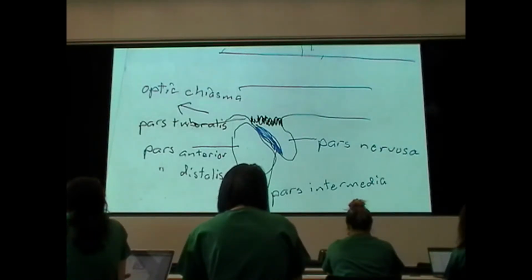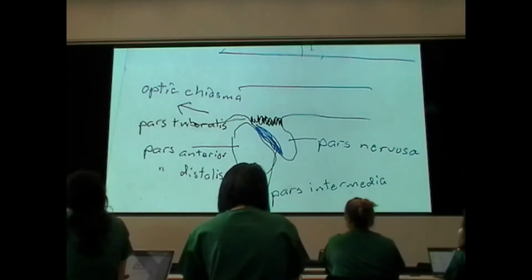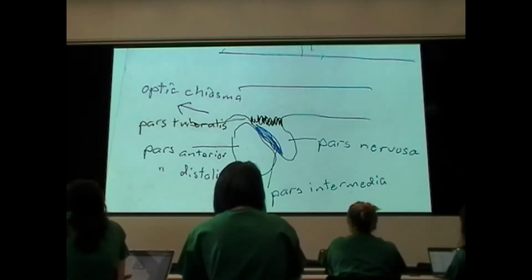Then what you do is you take a slide of pituitary unstained and flood it with this fluorescent antibody. When examined in a fluorescence microscope, which uses ultraviolet light as the source of illumination rather than visible light, what will happen is that the fluorescent antibody will link to the hormone in situ, and the cell that makes that hormone will light up.